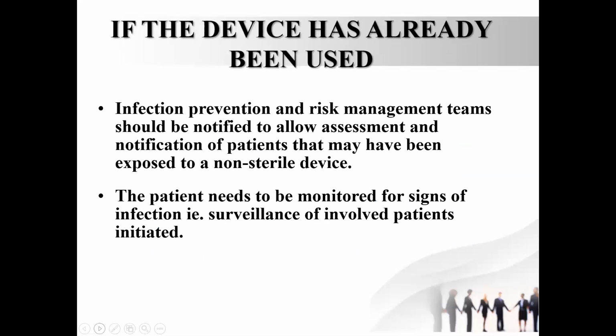I was asked during my lecture, what if the device has already been used by the time you call it back from the ward or any department? If it has already been used, then you have to inform the infection prevention and risk management teams.